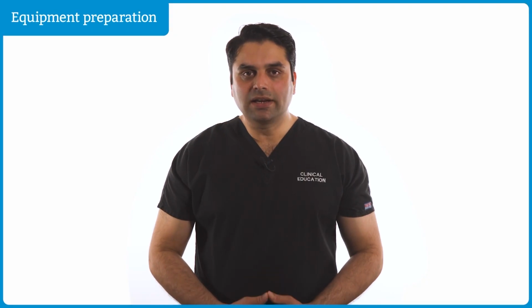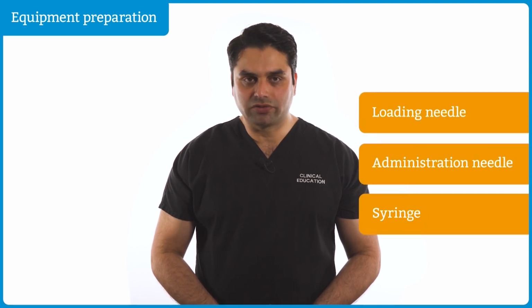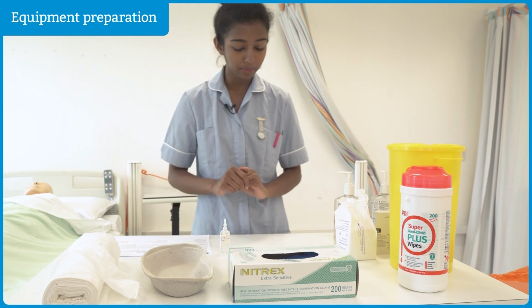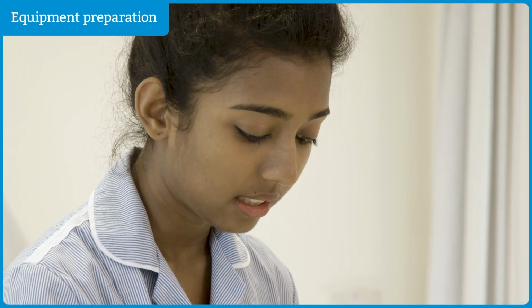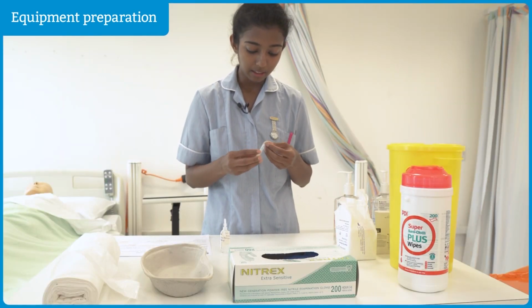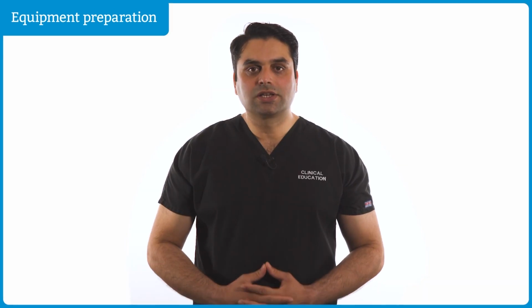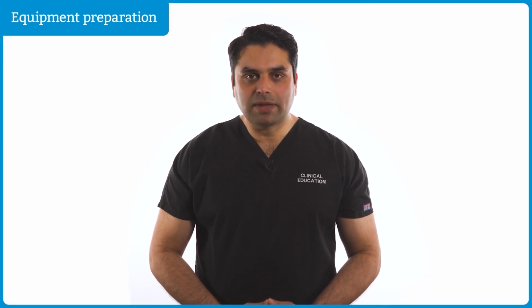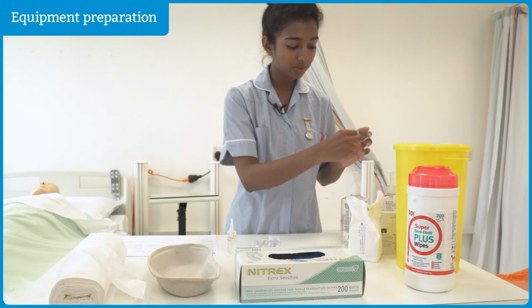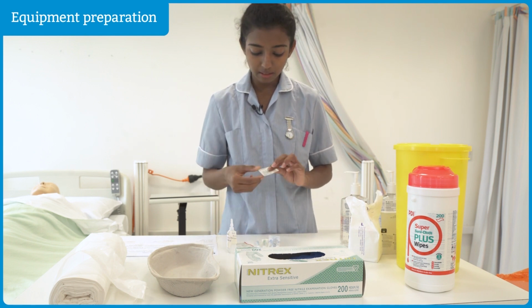Check the packaging and expiry date on each of the loading needle, administration needle, and syringe. So I've done the full prescription check and now I'll be gathering all the equipment that's needed. So I take the loading needle and I check the expiry. Its expiry is valid and its packaging is intact. Similarly, take 2 alcohol swabs and check the packaging and expiry date. So I take the alcohol swabs, 2 of them, and check its expiry and packaging is valid.